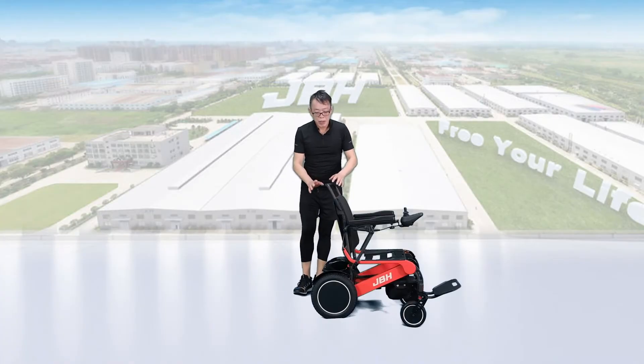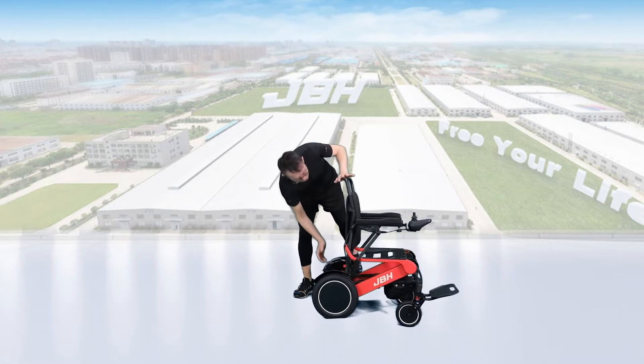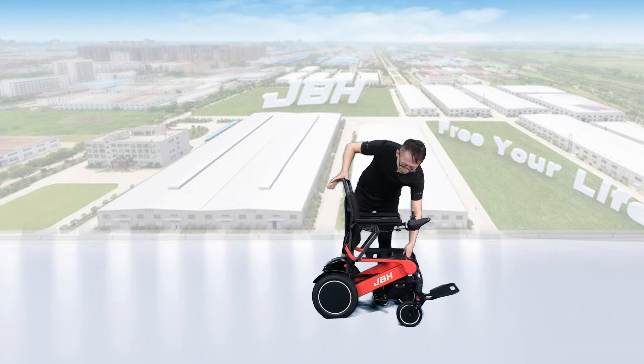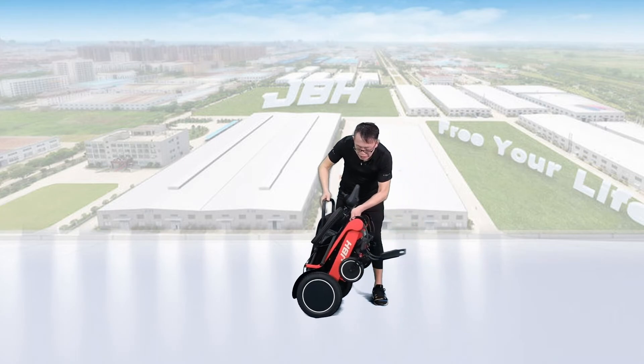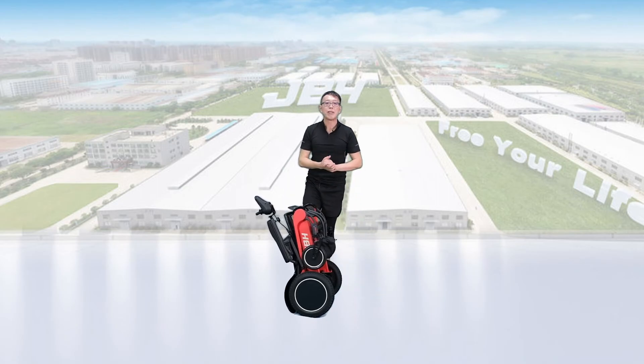To fold the wheelchair, it's really simple and easy. Just touch the button and at the same time push the seat back forward a little bit. One hand holds the front of the seat, the other hand holds the top of the backrest. Both hands push towards the center and you can close it in just one second. It's really simple and easy.